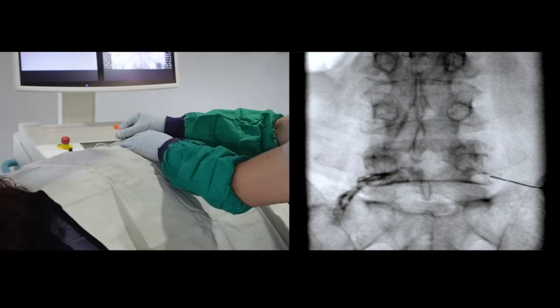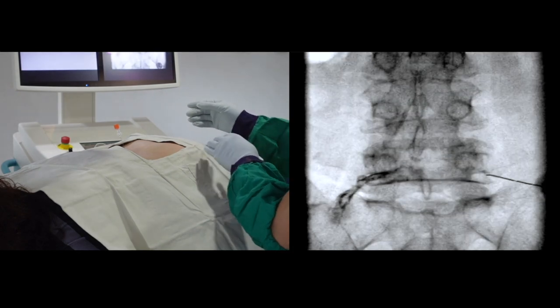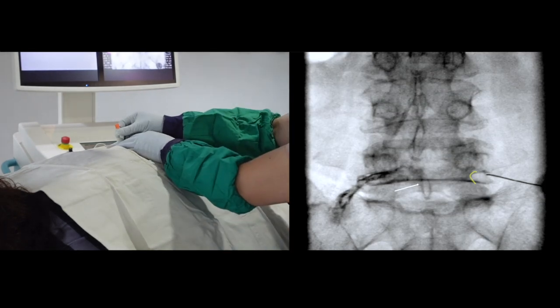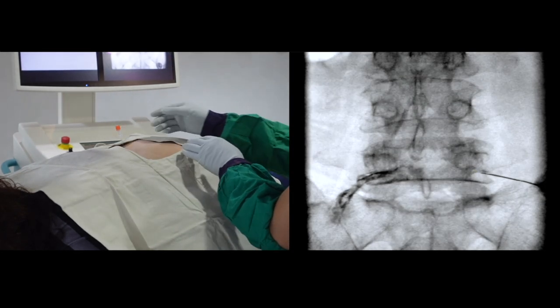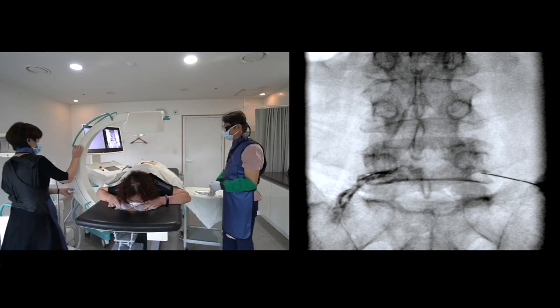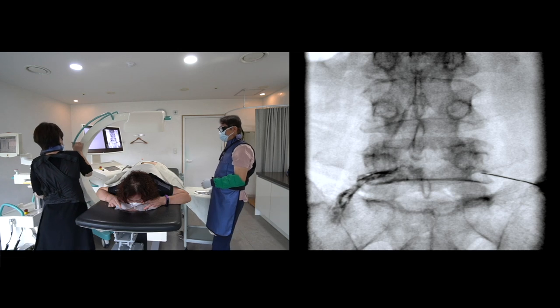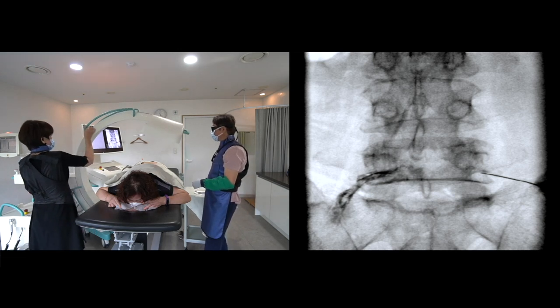If my needle trajectory is too flat, I may hit the lateral border of the bony structure, failing to reach the foraminal target. So make sure to create enough needle slope.